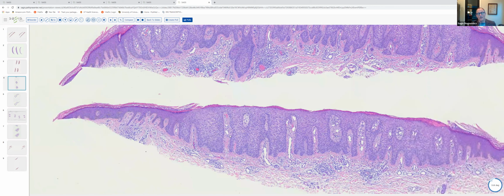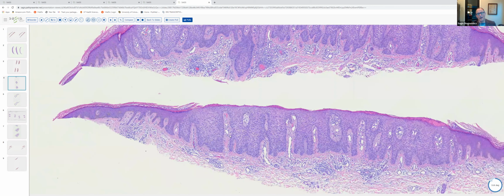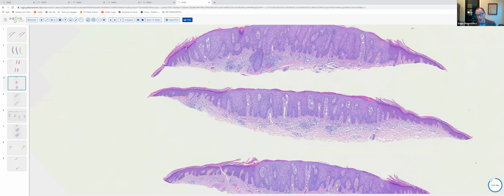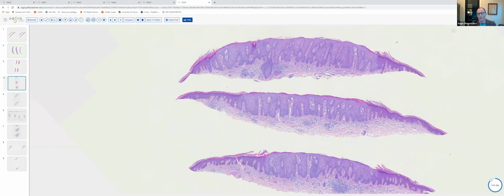Now, of note, take a look at the suprapapillary plates. They're thinned. There are dilated vessels here. And if we look in the cornified layer, there are even a few neutrophils. So there is histologic overlap between the changes in a pale cell acanthoma and psoriasis, okay? And on any certifying exam or any exam you take, they're always going to list psoriasis in the differential of a pale cell acanthoma because of the architectural similarity between the two. And slide number 5 was an example of plaque-like psoriasis.